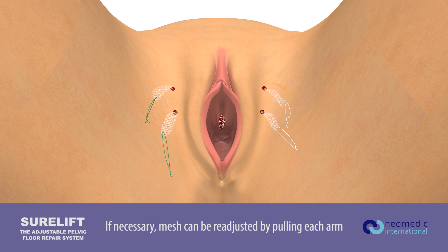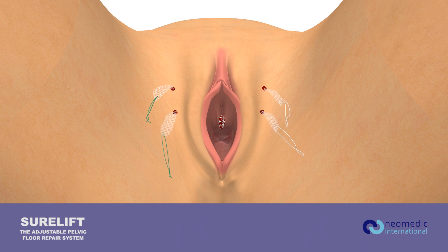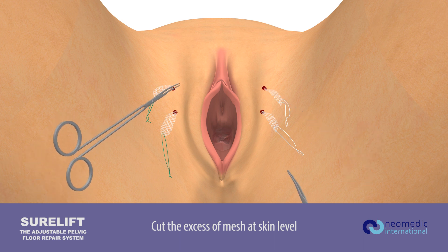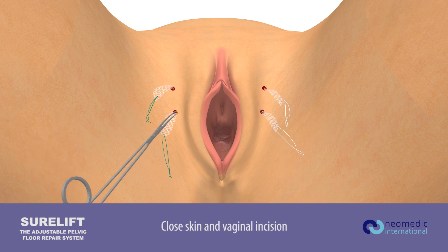If necessary, the mesh can be readjusted by pulling each arm. Cut the excess of mesh at skin level. Close the skin and vaginal incision.